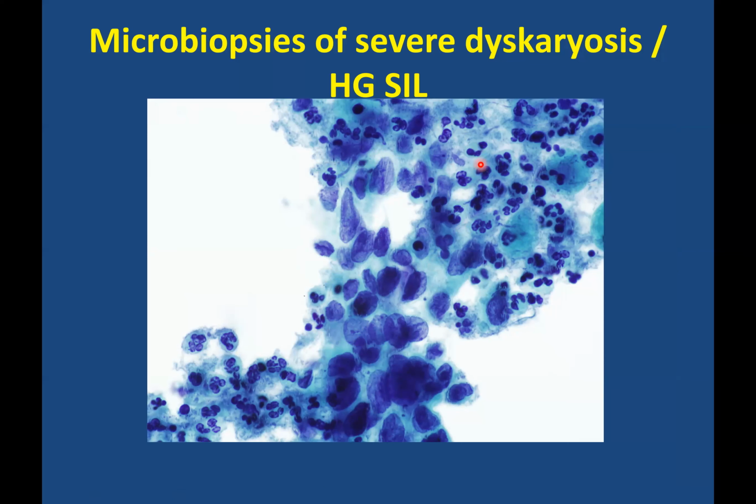We happen to also have a lot of inflammation in the background. When we look at these cells, in this instance, I think there's clear abnormal chromatin. We've got irregular nuclear contours, and a distinguishing feature from high-grade CGIN is that the quality of the cytoplasm looks cyanophilic. It looks as if it's squamoid. Also, you tend to have nice smooth edges. You don't have the feathering.